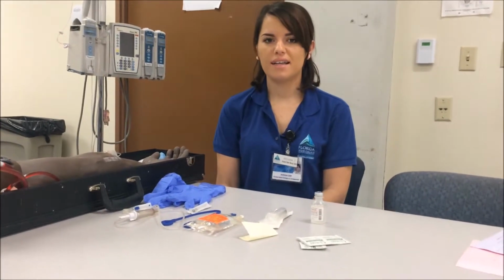Hi, my name is Ariana and I'm an FSCJ nursing student. Today I'll be doing an IV medication via piggyback.